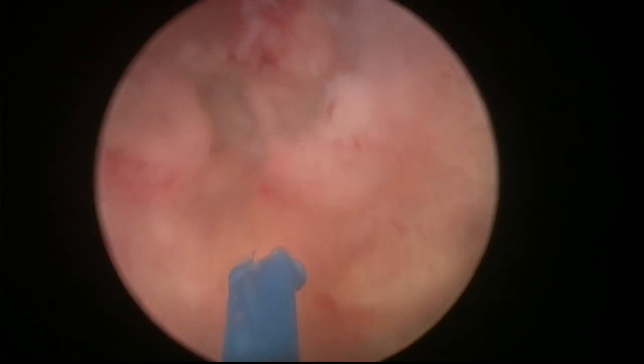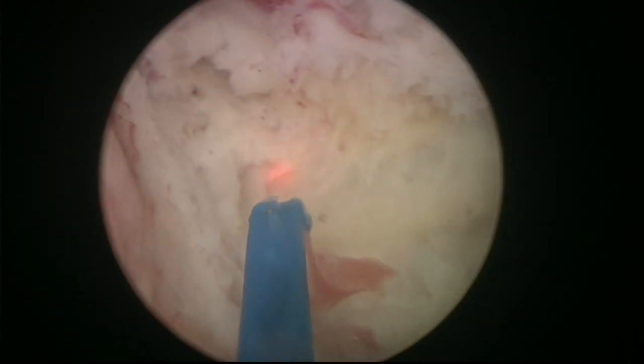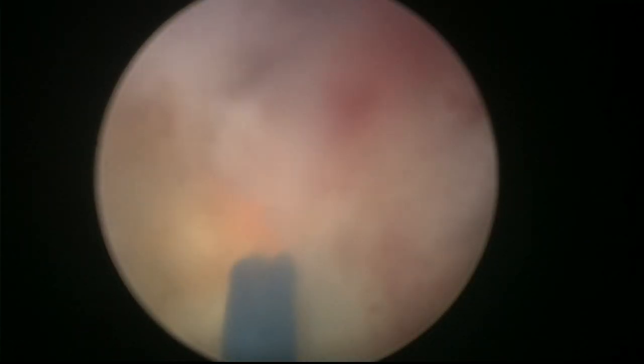So this would be the white line. I also like to prepare the posterior fibers here — basically I am cutting the attachment of the apical prostate with the sphincter, in the lower part near the verum montanum, and I will do the same thing on the other side. You'll see why this is important in a moment. This is the initial preparation.